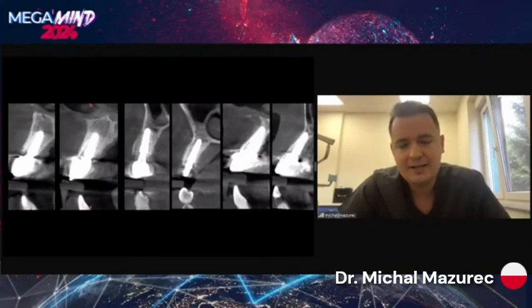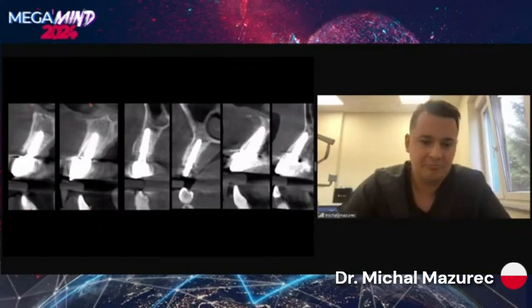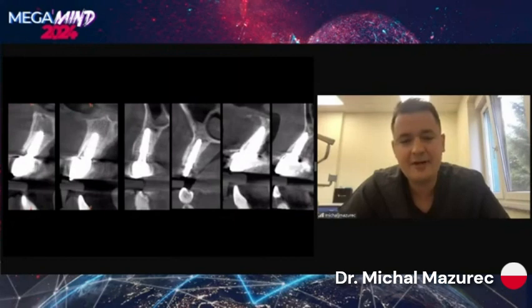So in this case, and in many, many cases, of course, the technique itself is very sensitive. That's why I think a guided solution will make it more used in daily practice by more dentists, and dentists can deliver high aesthetic, very difficult treatment to more patients.